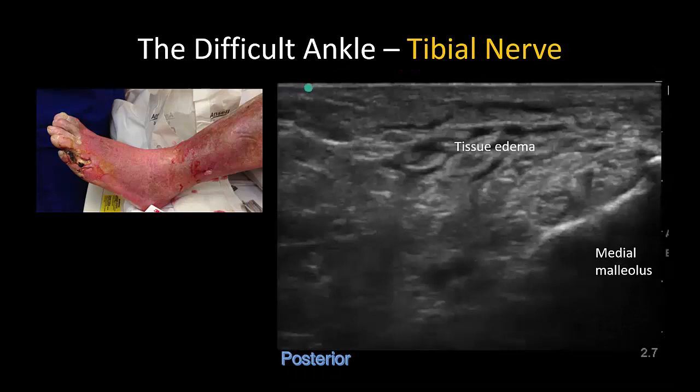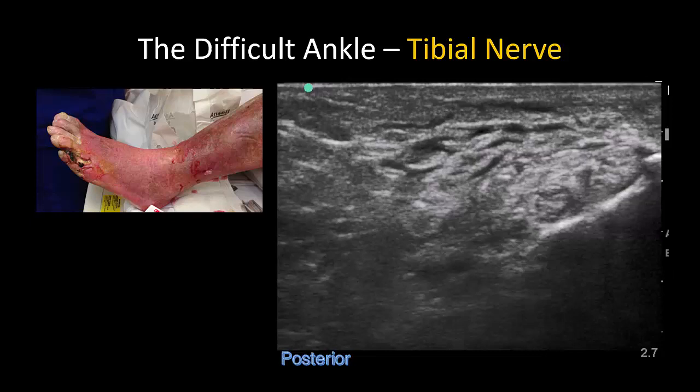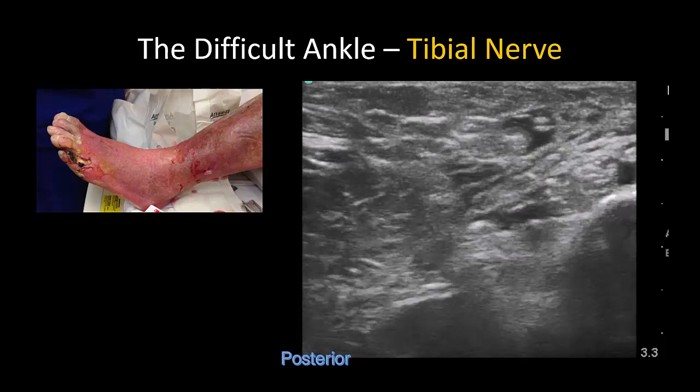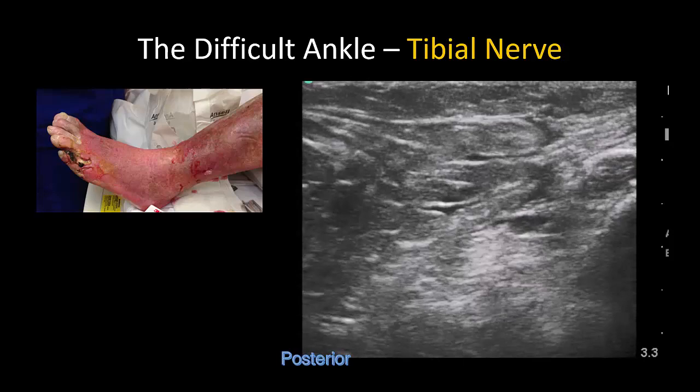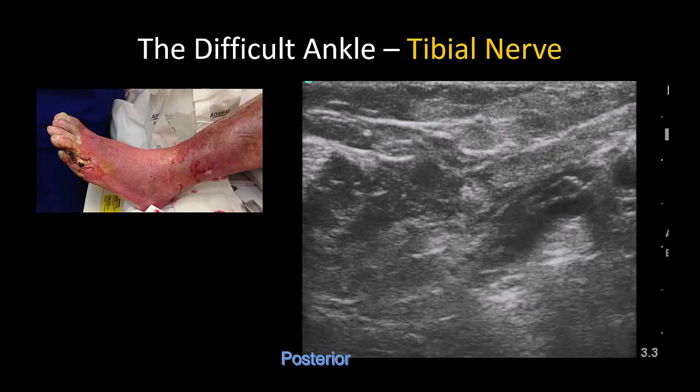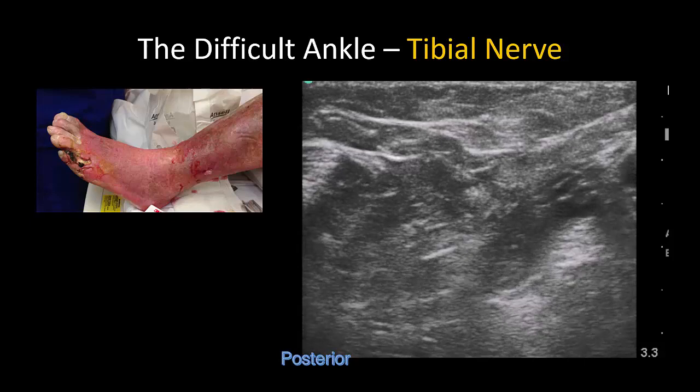Here is a video in a patient with significant tissue edema that again contributes to poor image quality. Nevertheless, the posterior tibial artery is recognized by its pulsation. Back and forth scanning with probe tilting reveals a hyperechoic structure posterior to the artery beneath the overlying fascial layer — this is the nerve. The needle tip is located by generating tissue motion and by tactile feedback from puncturing the overlying fascia. Fluid injection confirms spread within the compartment around the tibial nerve.